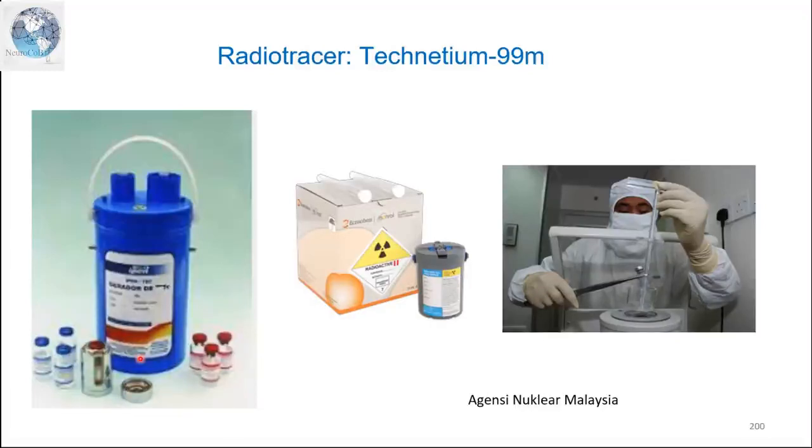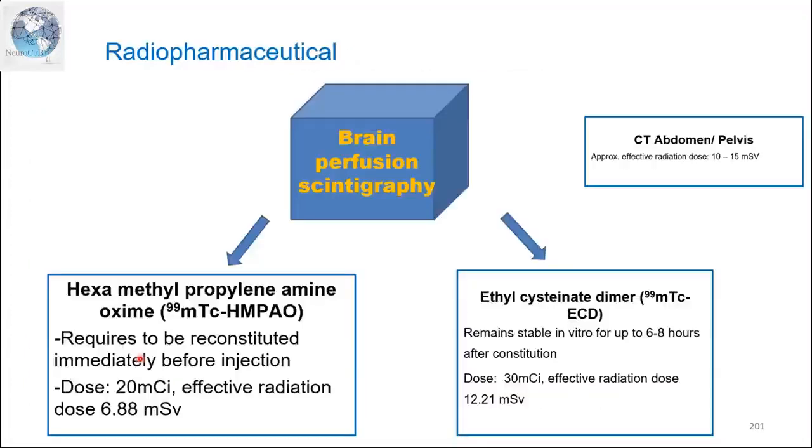Okay, so this one dapat dihantar ke many centers. That's why the nuclear medicine yang ni, kita panggil general nuclear medicine, lebih banyak center yang boleh mampu sebab dia boleh tahan lama. Whereas F18 ni mahal sikit untuk buat PET scan. Okay, so maybe limited centers or banyak yang private center dekat Malaysia banding government or public centers.